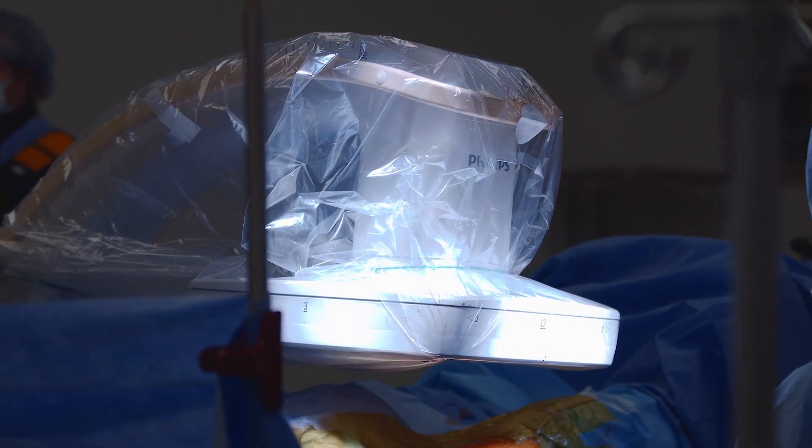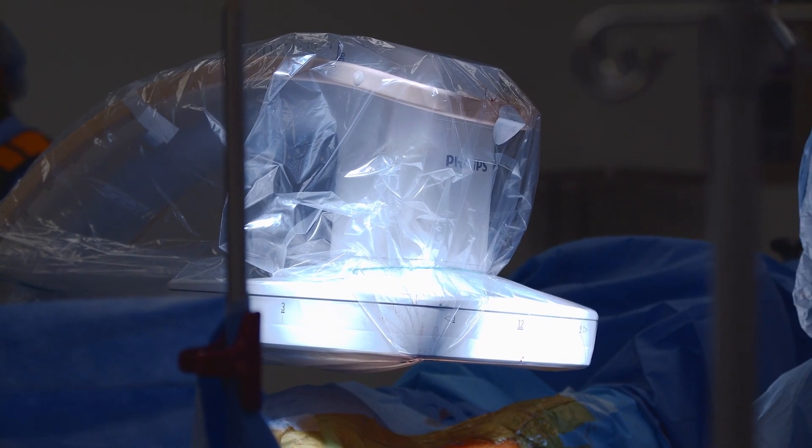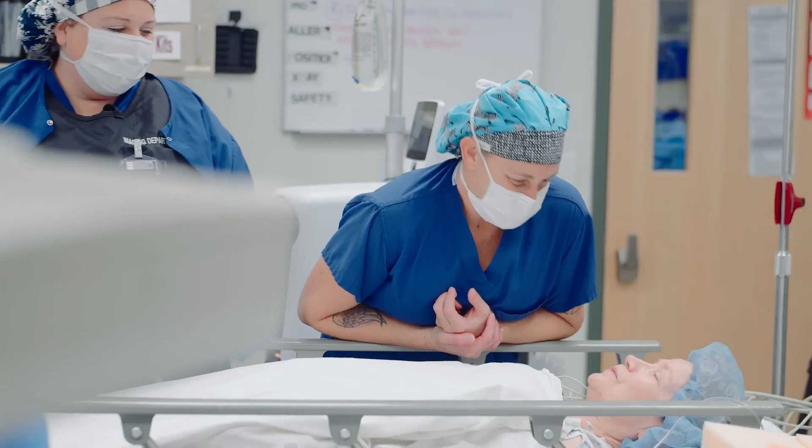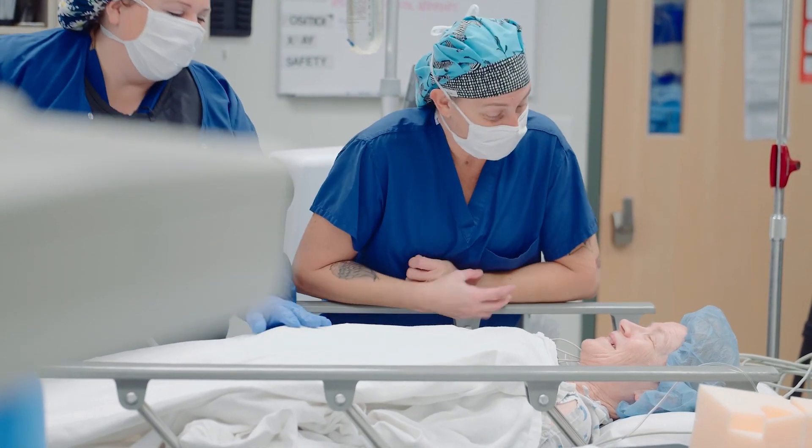I've used a lot of different C-arms over the course of my career. The Philips Zenitian specifically has provided me with better efficiency, better image quality, better surgical outcomes, and better knowledge of exactly what's happening during and after the case. It's been good for my institution, it's been good for my staff, and most importantly, it's been good for my patients.